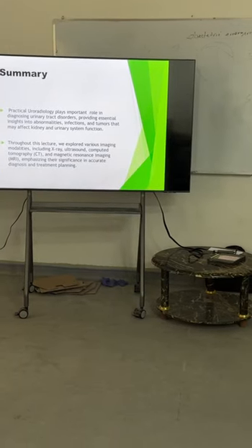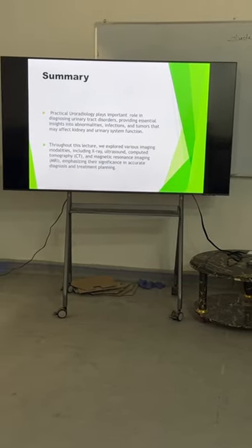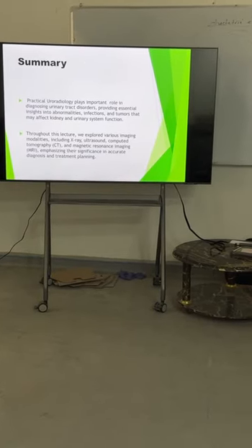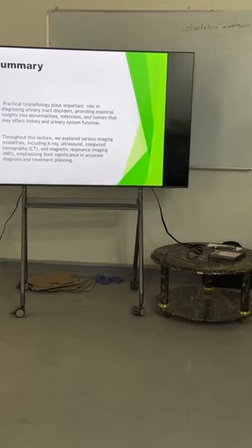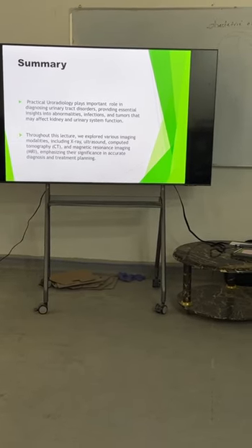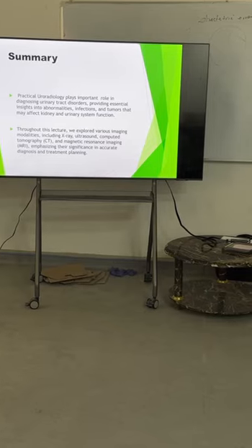Summary. Practical uroradiology is very important, playing a very important role in diagnosing urinary tract disorders, infection, tumors, by using different types of imaging modality to get what? Accurate diagnosis.